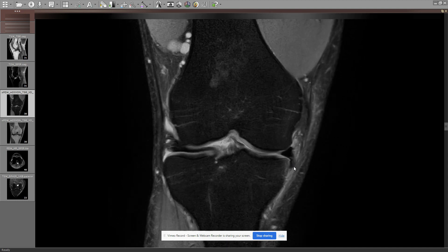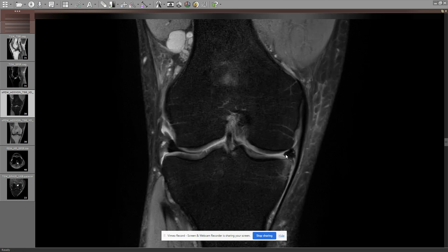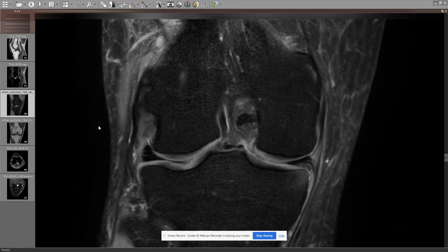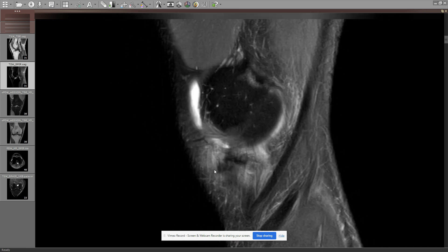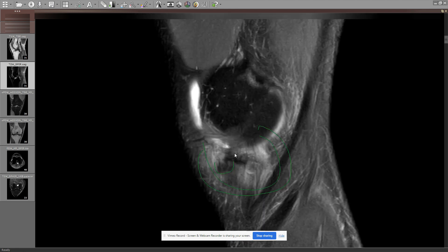There's a part of the meniscus on the surface like a large flap — I might actually measure this, seven millimeters, six millimeters — swept over the edge into the meniscus cutter where we can see the truncation here. We might also describe that in more detail. We can see the horizontal tear, so it's actually more than just a horizontal tear; it's more like a complex tear with a flap component. You can see this piece, the flap going over the edge, and then there's bone marrow edema and capsular irritation on the posterior medial side of the knee joint.